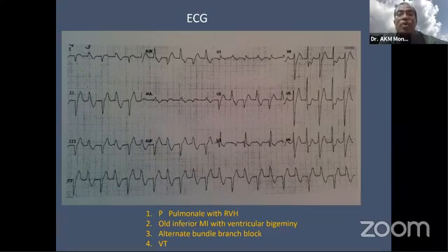And also, if we look at lead V1, there are also positive complexes in lead V1. So this may also be important because of the presence of other pathology like inferior MI with posterior extension.